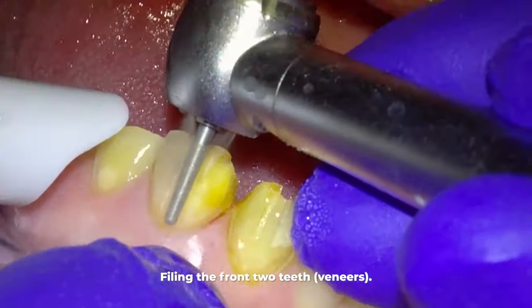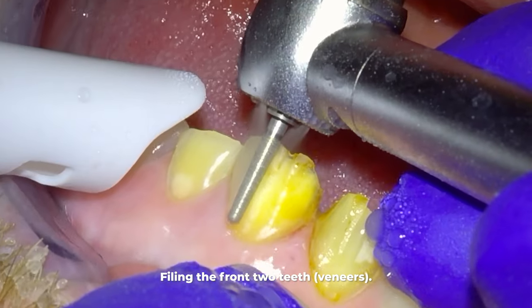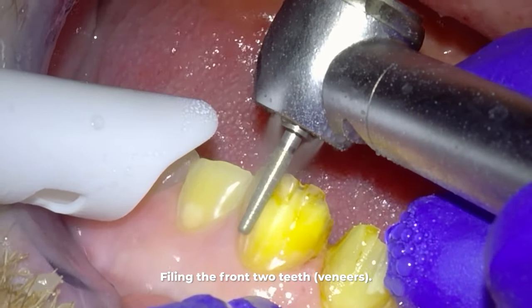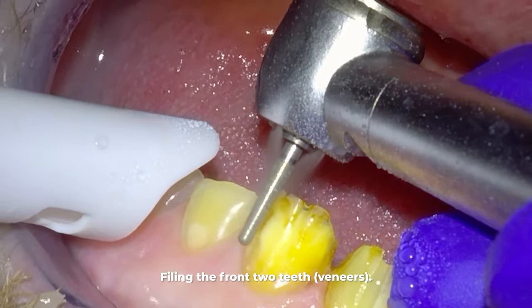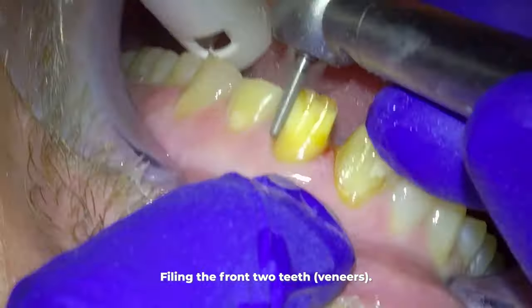You're probably noticing how yellow the underlying layer called dentin is on the patient. The dentin is always more yellow than the outer enamel portion of the tooth, but this is actually an unusually intense yellow, which is why his teeth are so yellow.